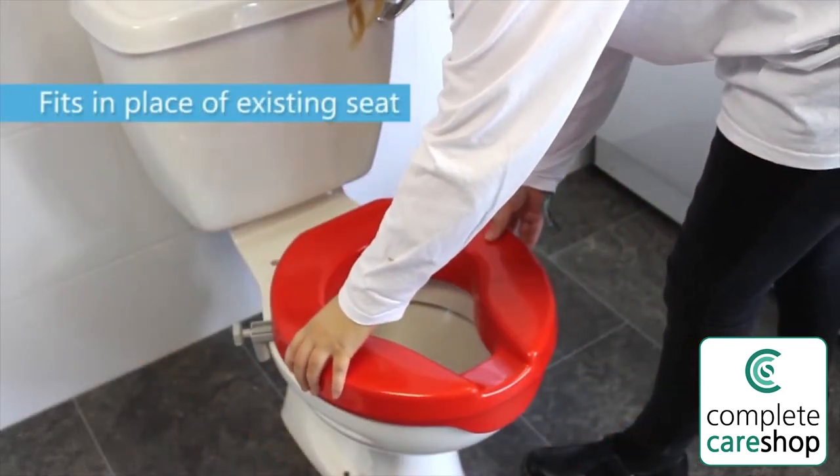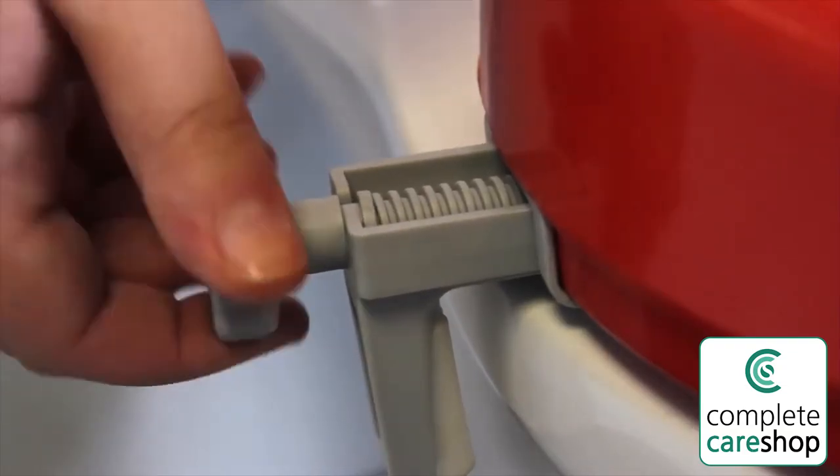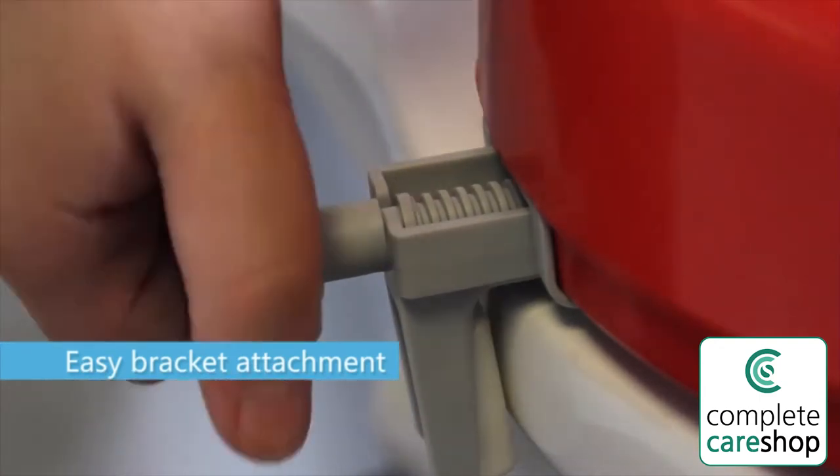The seat is easy to install and fits in place of the existing toilet seat with simple brackets that feature large, easy-to-turn hand wheels.